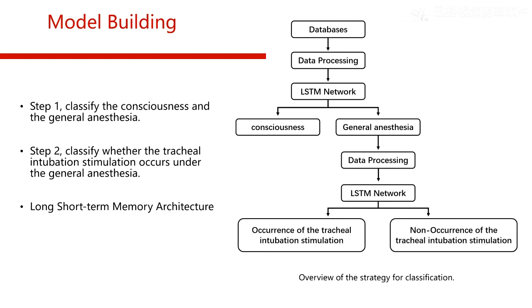First, we use data processing and feature extraction to separate the consciousness from the general anesthesia. Then, we further extract the features of the anesthesia signals to find out whether there is a noxious stimulation.